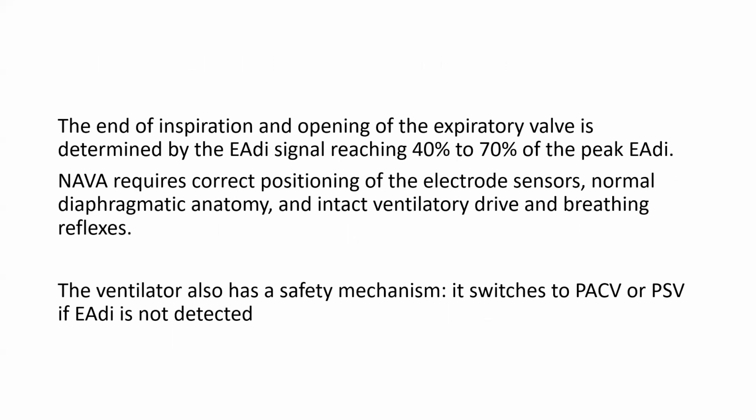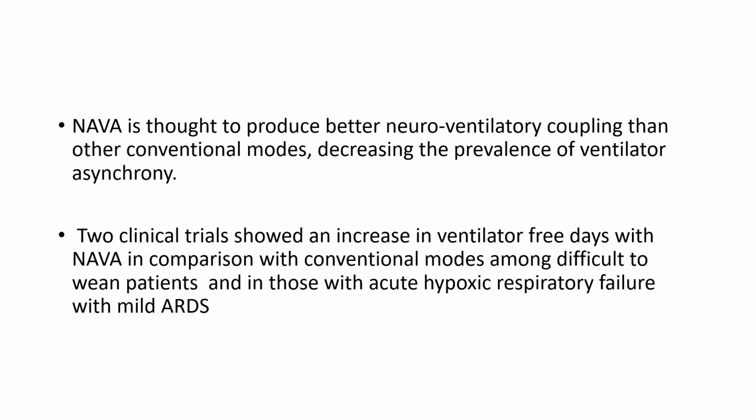NAVA requires the correct positioning of the electrode sensor, normal diaphragmatic anatomy, and intact ventilatory drive and breathing reflexes. The ventilator also has a safety mechanism. It switches to pressure assist control ventilation or pressure support ventilation if electrical diaphragmatic activity is not detected.